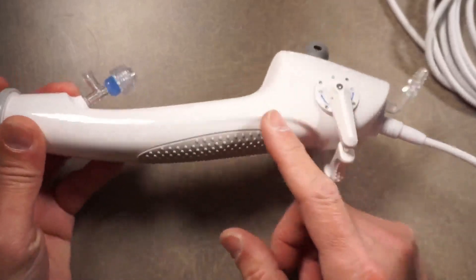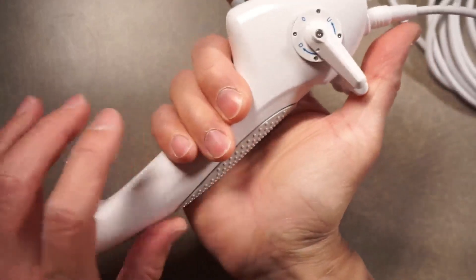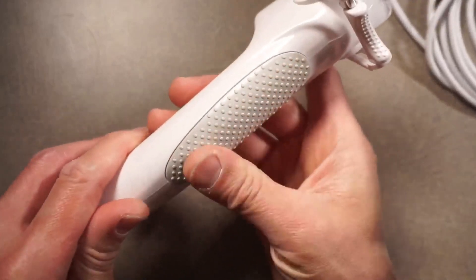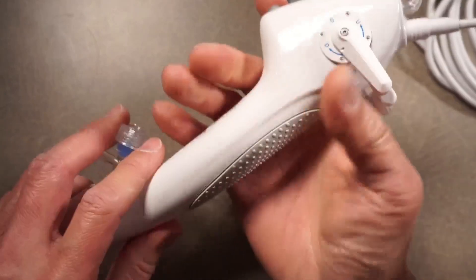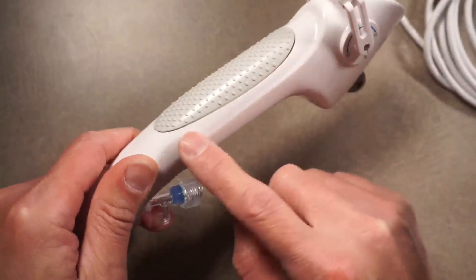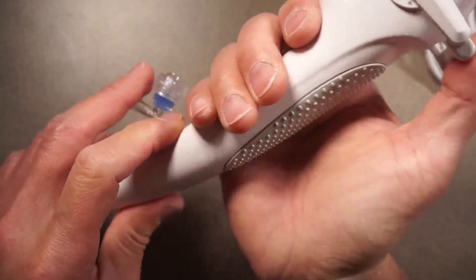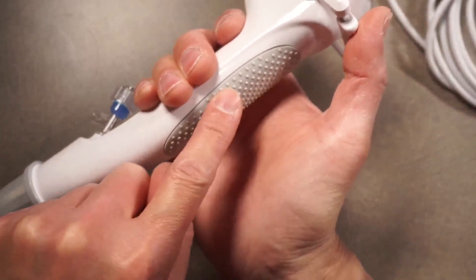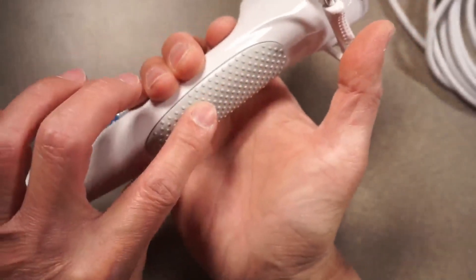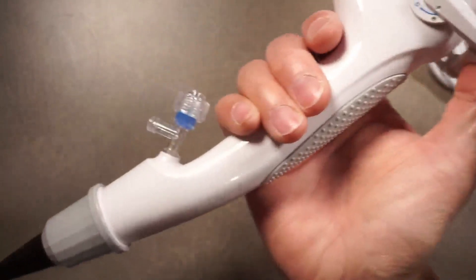Moving a little more distally, over here is where your palm would go when you're holding the scope. I'm almost never holding it in this spot, so I'm not sure how useful this grippy surface is here. If you want to make it grippy, you might want to move it over to the side so that when I'm holding it, my palm and fingers are contacting the side rather than this area. Free advice to the Vathin reps and Vathin manufacturing.